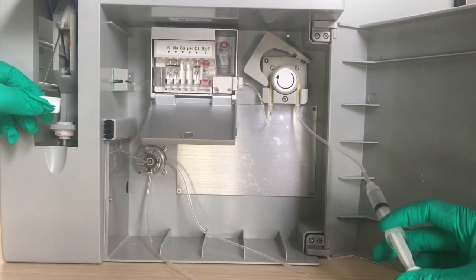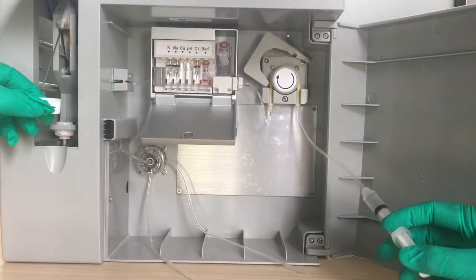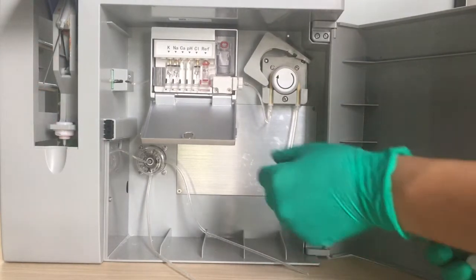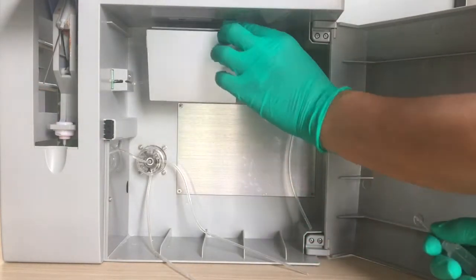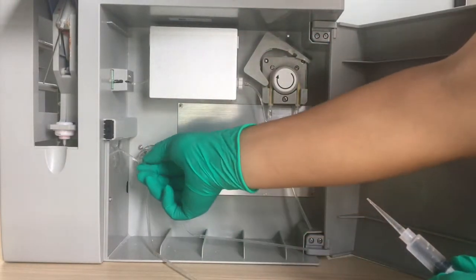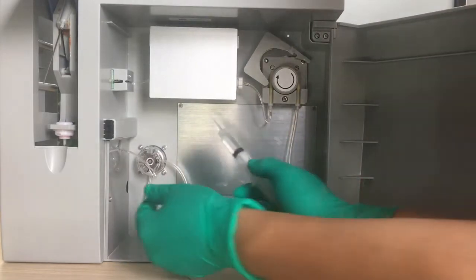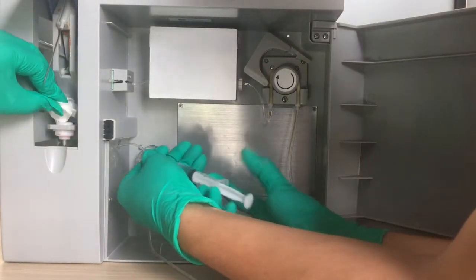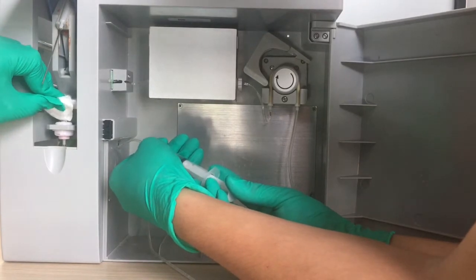Then we can see if water comes out from the sample probe. If there's water, this part is smooth with no blockage. Then we take this off, connect with the syringe, and put it there with tissue.